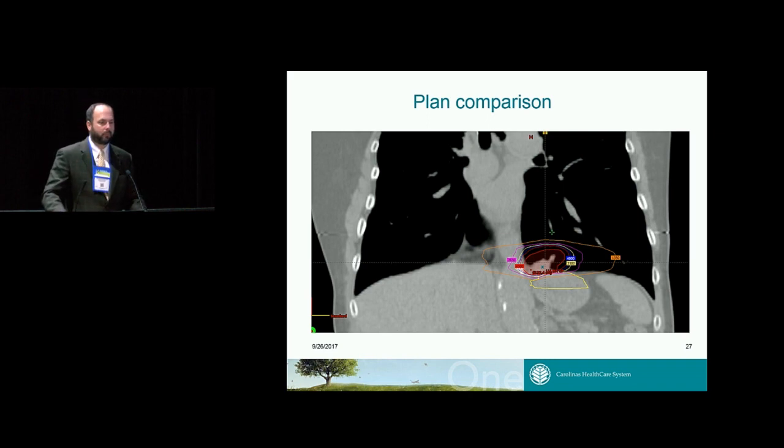During treatment, do you do any imaging to detect the target motion during treatment, not before? I mean, like the idea of CyberKnife. In CyberKnife, you are taking imaging during the fraction itself? The only time we're doing intrafraction imaging is with triggered imaging. So what I showed for the prostate case, we do it for spine as well, but it's not going to track. For spine, it's not going to track. It doesn't have a fiducial to track.